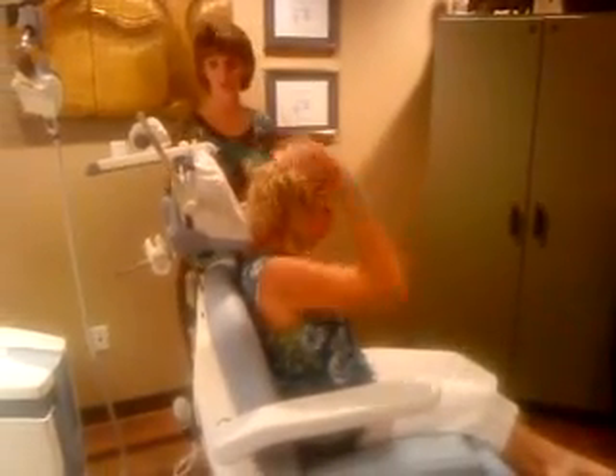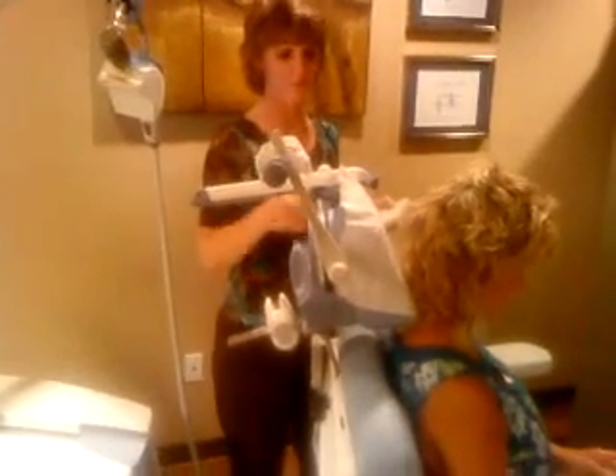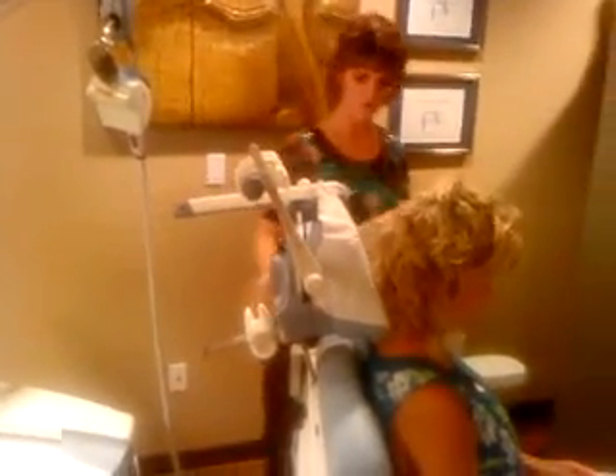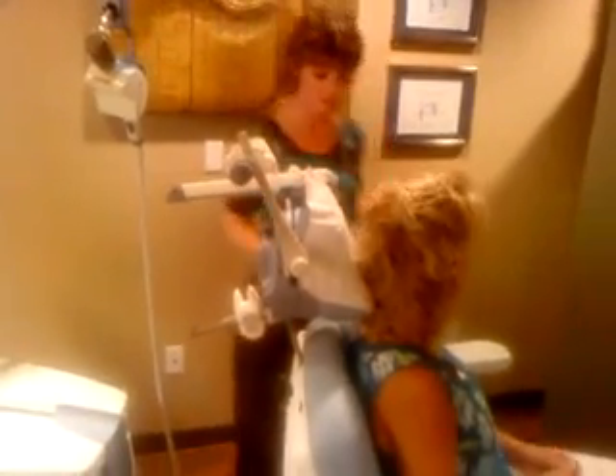All of the adjustments are done pre-treatment, including height adjustments depending on how tall someone is, and adjustments for various locations.